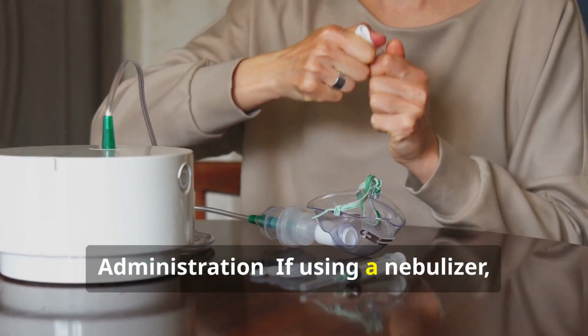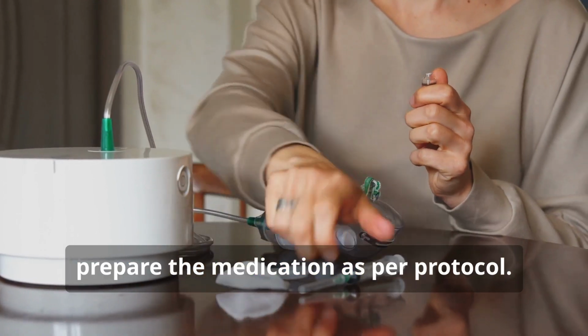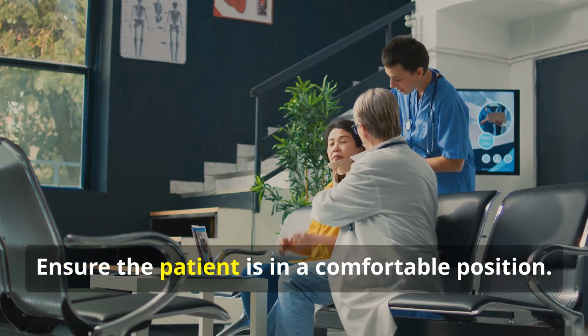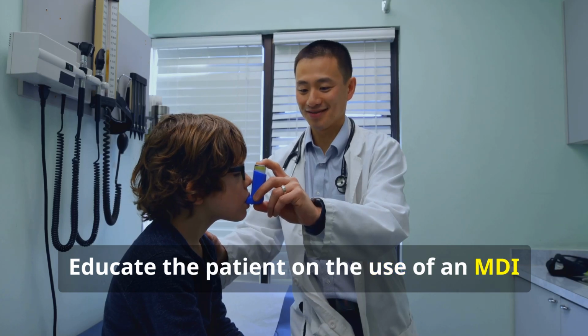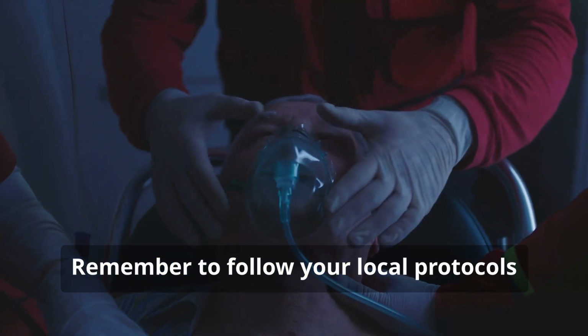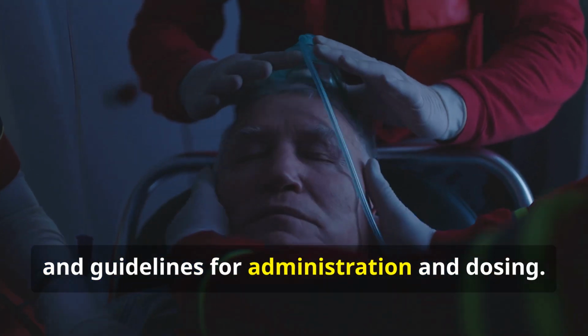Administration: if using a nebulizer, prepare the medication as per protocol. Ensure the patient is in a comfortable position. Educate the patient on the use of an MDI if applicable. Remember to follow your local protocols and guidelines for administration and dosing.